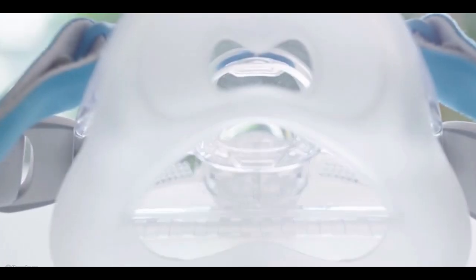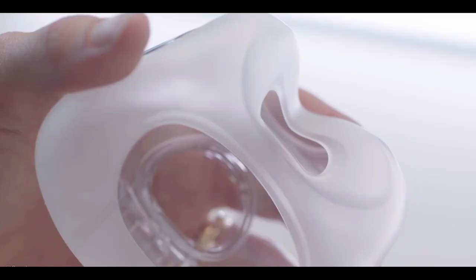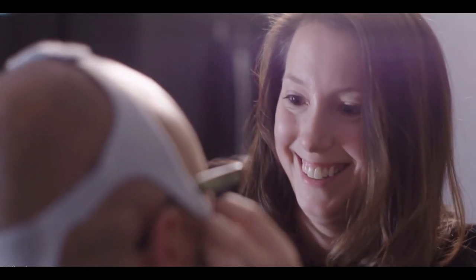The Evorafil mask has a soft silicon seal that works in combination with our frame and our stability wings. It's super soft and super comfortable, but when they move around at night, those stability wings keep the geometry of the seal and stop it becoming unstable.